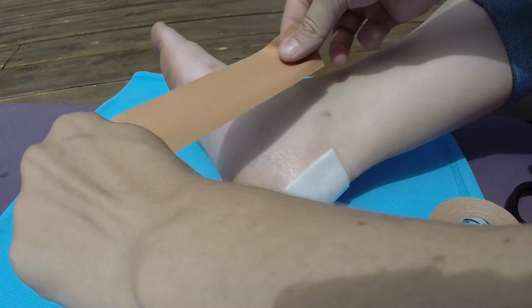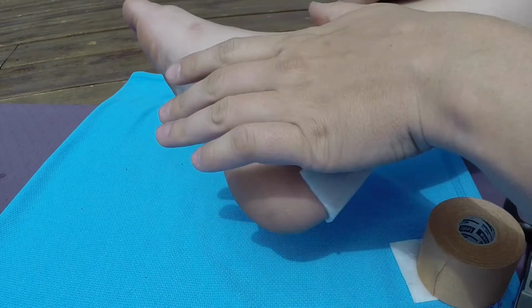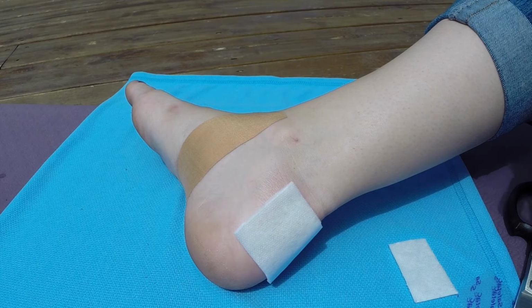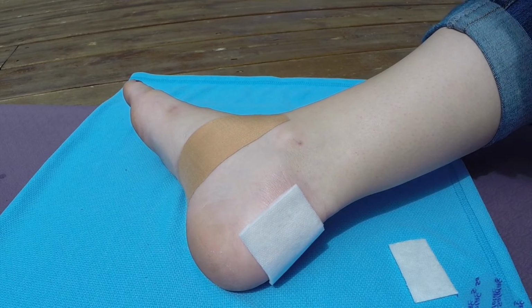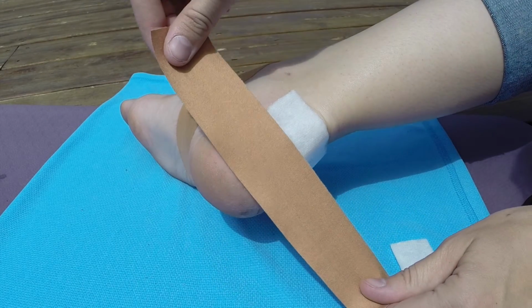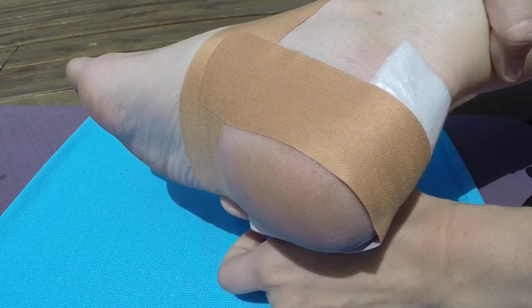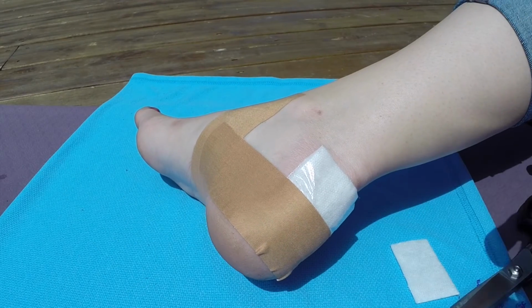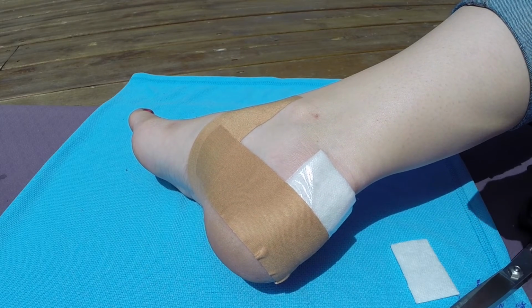So be sure when you do this that you've got your foot in a nice relaxed position, that it's not too tight and it's not cutting off any circulation. Then you can basically put overlapping strips of tape and secure them to the anchor tape itself. First one there. I'm going to try to keep your foot relaxed and not to apply the tape too tight. If it's too tight, it's going to cut off the circulation.